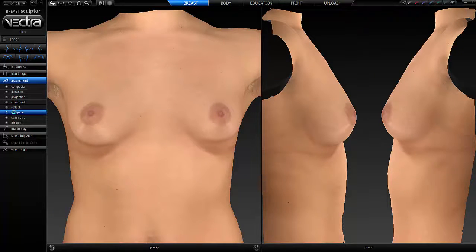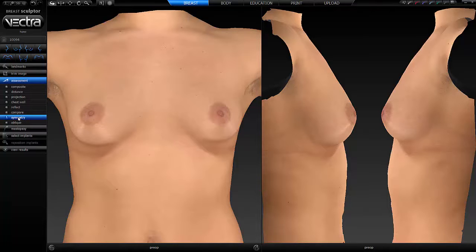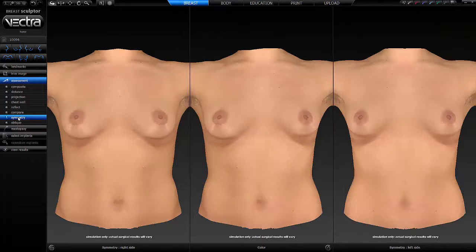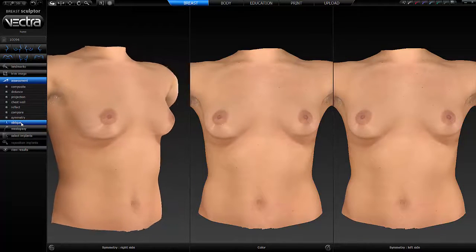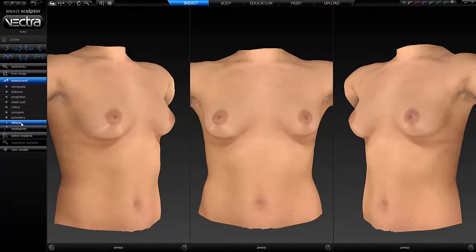The chest is split in half and rotated inwards, so that the difference in contours of the two breasts can be viewed from the lateral aspect. To examine further for asymmetry, the left pane shows the chest with the right breast cloned onto the left side as a mirror image, the right pane shows the left breast cloned onto the right side as a mirror image, and the center pane is the actual subject. The right and left panes can now be compared.